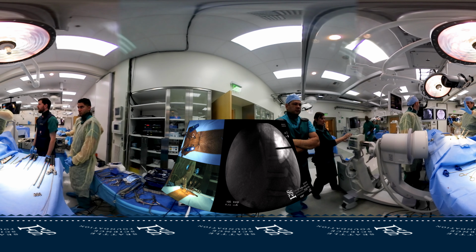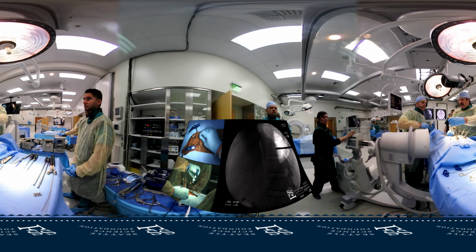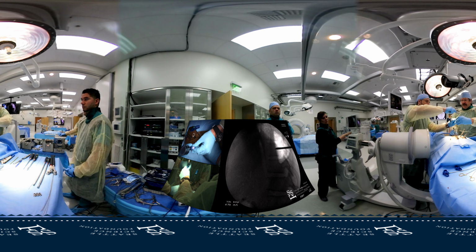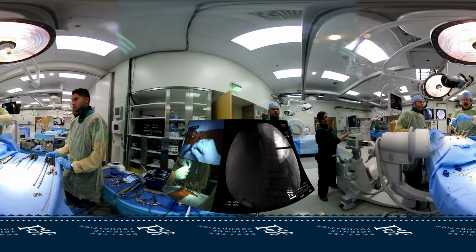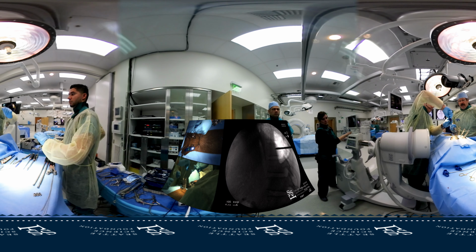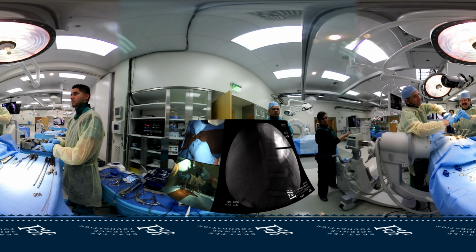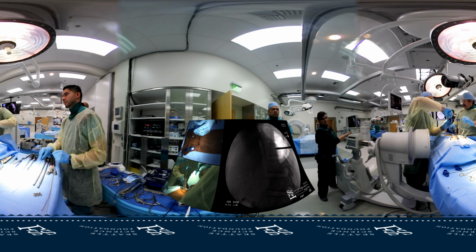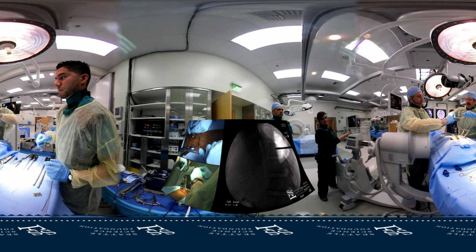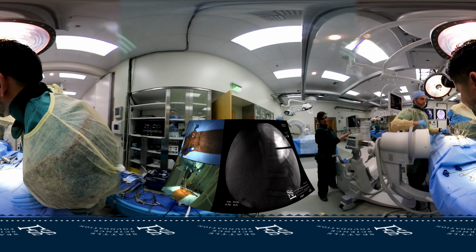Okay, so if you look, those are in the back of the vertebral body. So if I want, go ahead and tap them a little more. I can tap them in just a bit further. Good. And this one. And I'm pretty safe. So I know those are not broaching the medial canal. I'll stay in lateral now and I'll put my guide wires in. Usually I can push them in, but sometimes if they're a little bit stubborn, I'll grab them with a bulldog or heavy needle driver and tap them in like that.